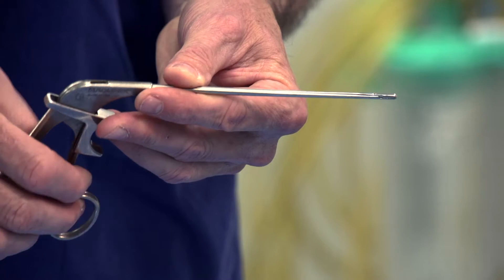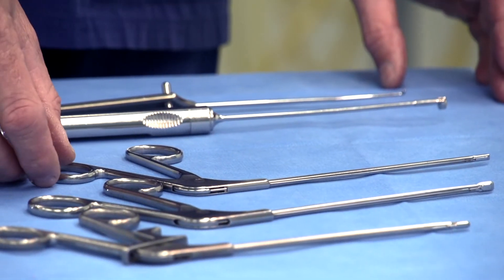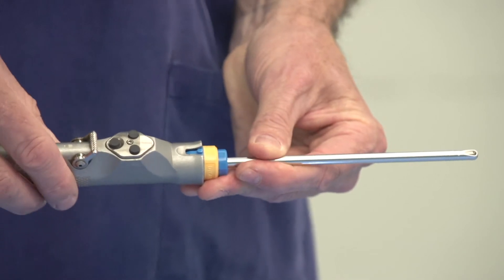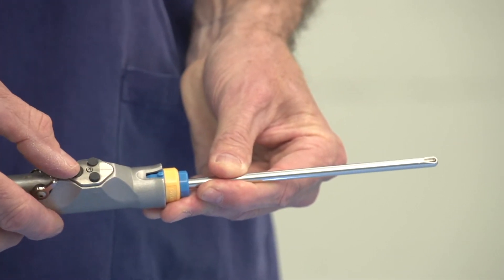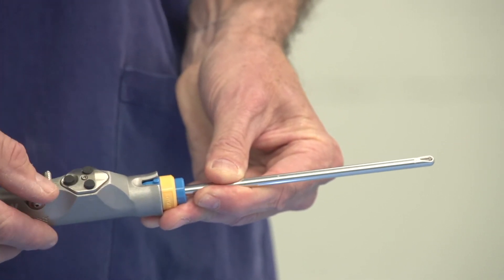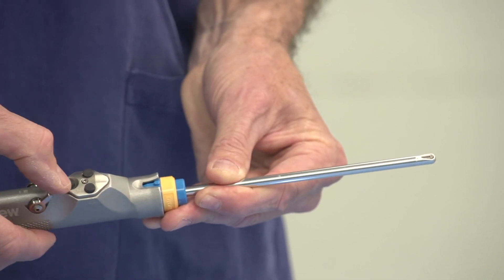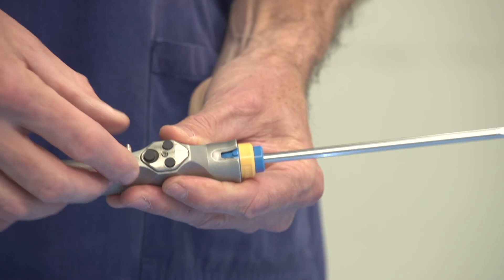We then insert these instruments to perform the surgery. This is our shaver. This allows us to remove loose fragments or to smooth the joint surface. It has a very small oscillating blade inside the shaft.